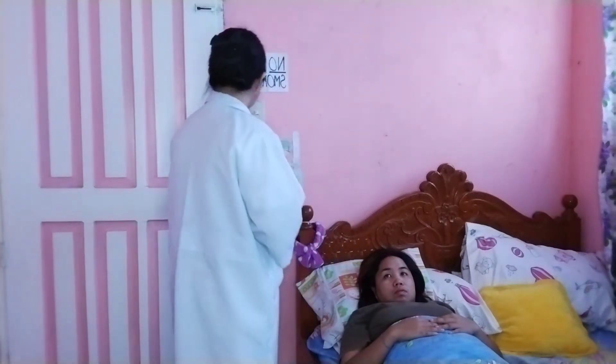Then close curtains around the bed and close the door to the room if possible. Then explain what you are going to do and the reason for doing it to the patient.